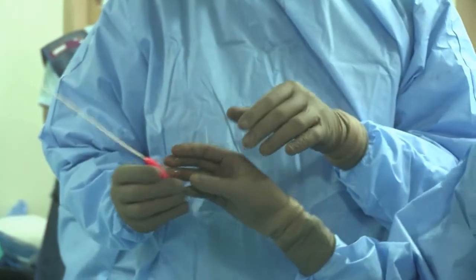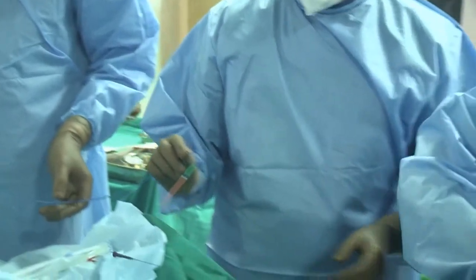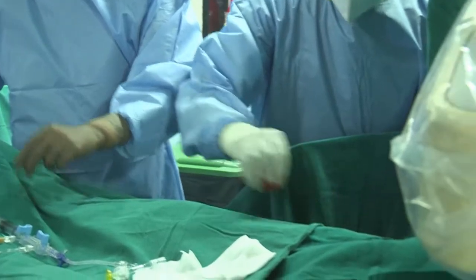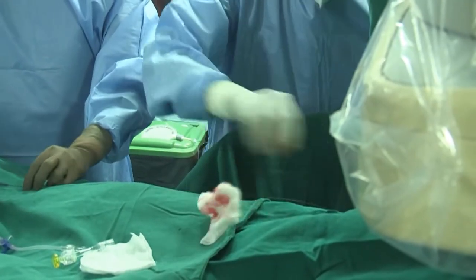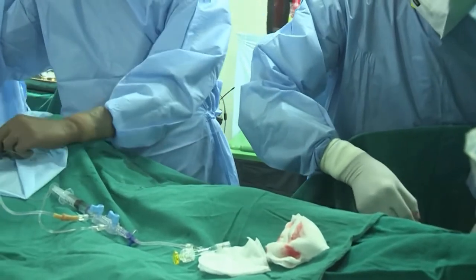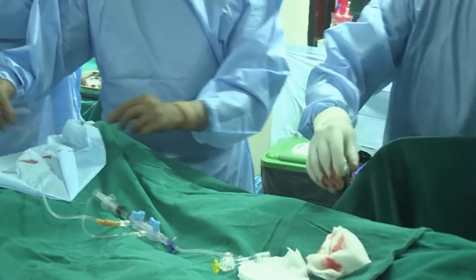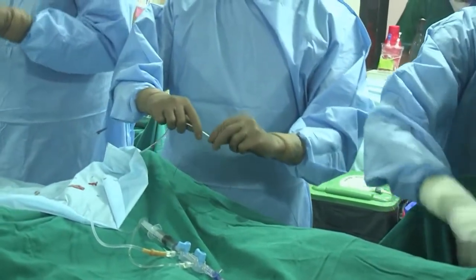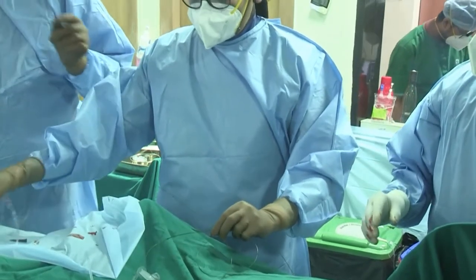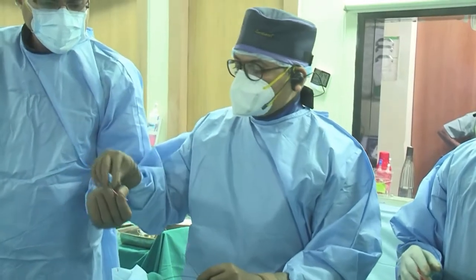Dr. Pillai sir is now wiring the radial through the 5 French. We have to take a double length wire whenever we are exchanging like this. So this is a double length wire, and we'll remove the sheath and insert this system, and then we are ready to go. Because he's exchanging now, they're using the double length wire, but if you do it directly, probably you can put that special wire which comes with this, as shown in the previous lecture, and you can directly take this catheter.